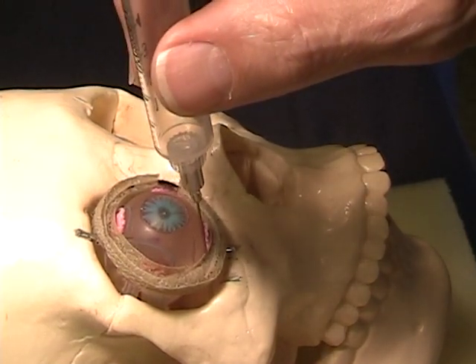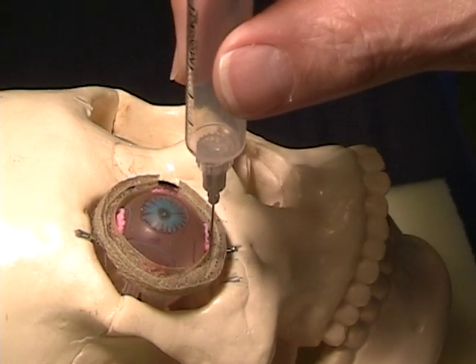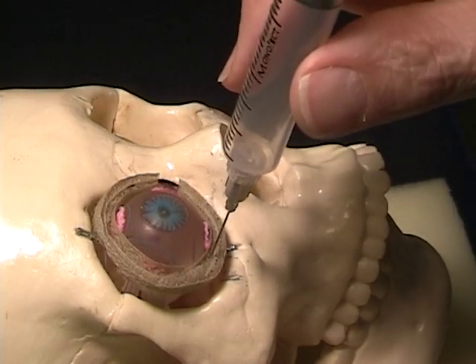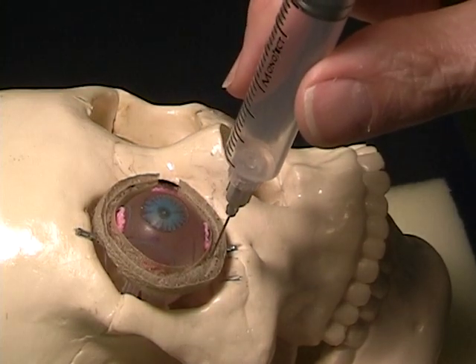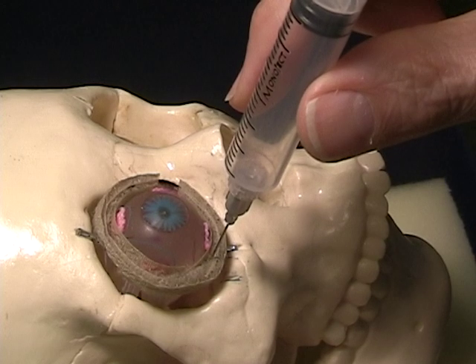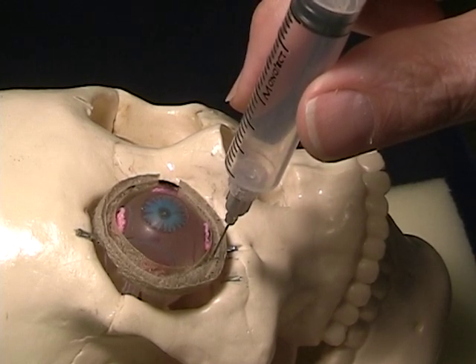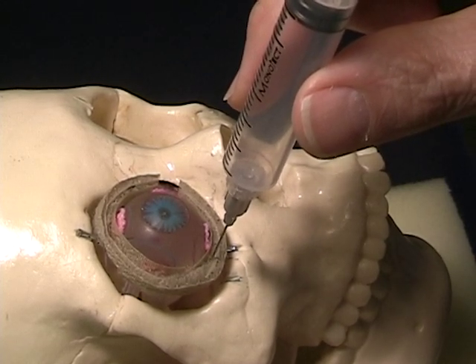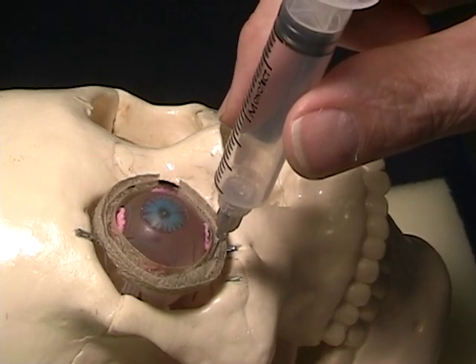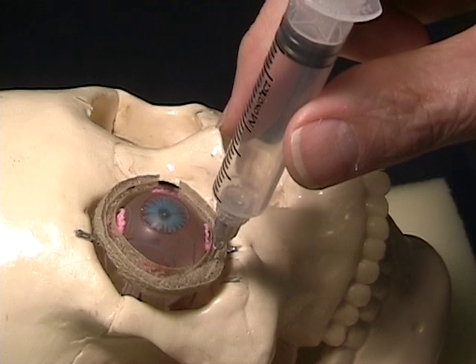We'll go through the conjunctiva approximately 2 millimeters, or the length of the bevel. At that point, we'll rotate the syringe to a 90-degree angle and reassess our landmarks, making sure we're lateral to the lateral limbic line. Once we've completed that, we'll start a slow insertion of the needle to its full depth of 1 inch or 25 millimeters.